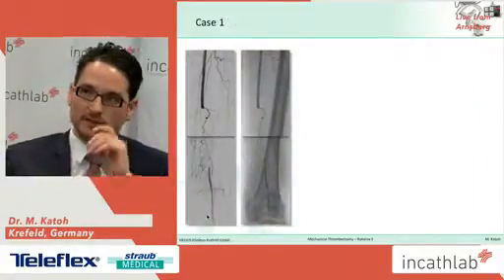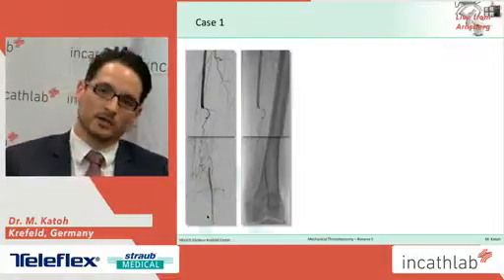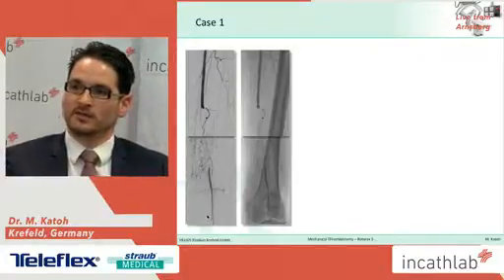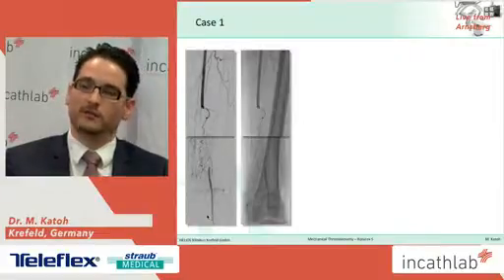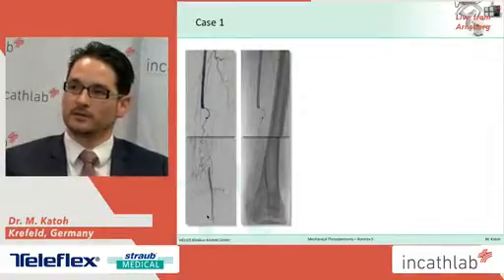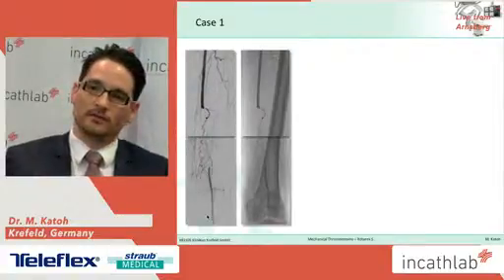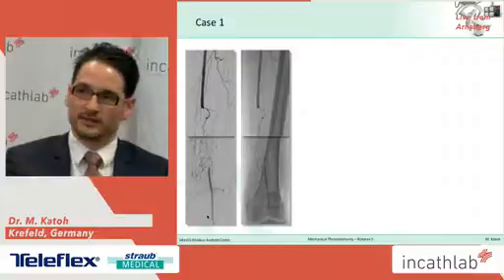This is one case we did last week, a 70-year-old female patient with acute onset of pain in the left leg. And you can see a quite long occlusion of the superficial femoral artery in the Hunter's canal. You can appreciate the quite typical proximal end indicative of thrombotic emboli, and you can also see the multiple collateral vessels.